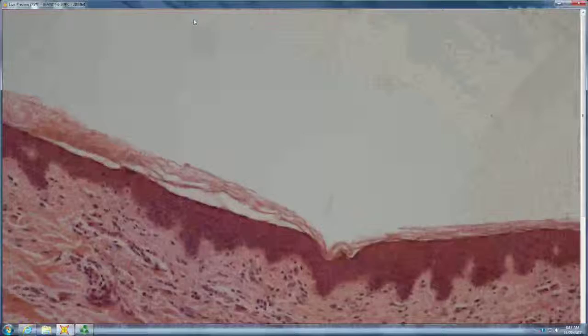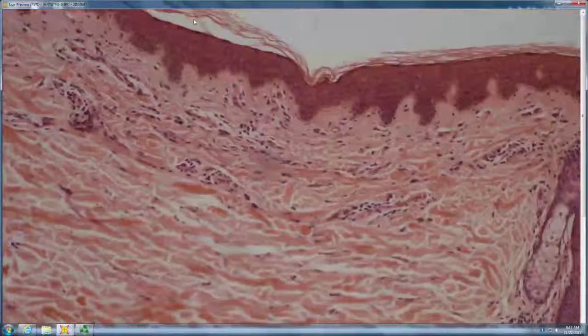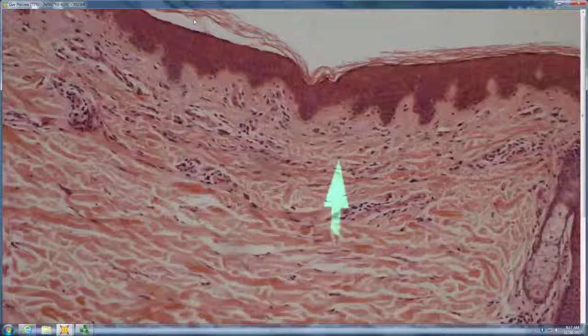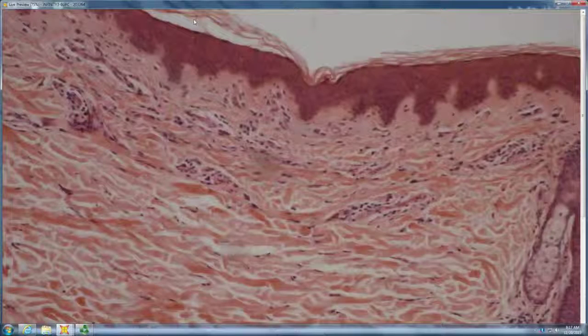Seen a whole lot of that? Not a whole lot. Okay, so you can run through your differential. The one that happens to be in this chapter where you have these spindle cells that are a little chunky, a little granular, and would happen to stain with a Leder stain would be spindle mast cells, so it's like TMEP again. Yeah, so TMEP, telangiectasia macularis eruptiva perstans. It's under that urticaria pigmentosa umbrella, sort of.